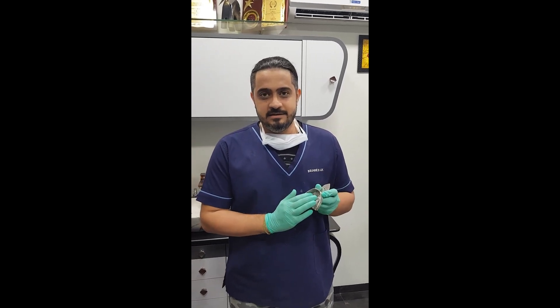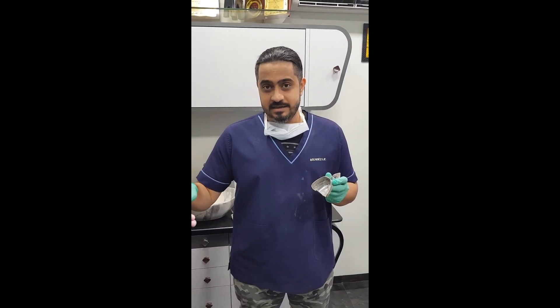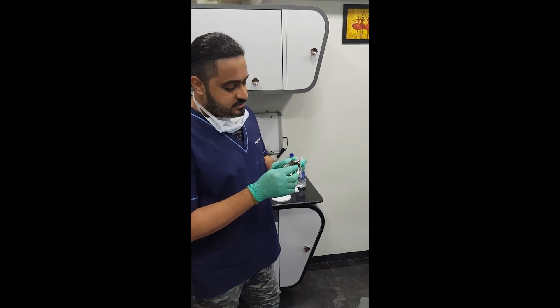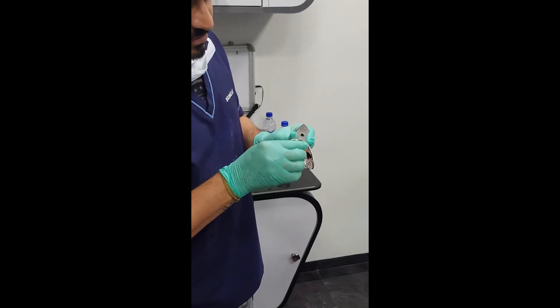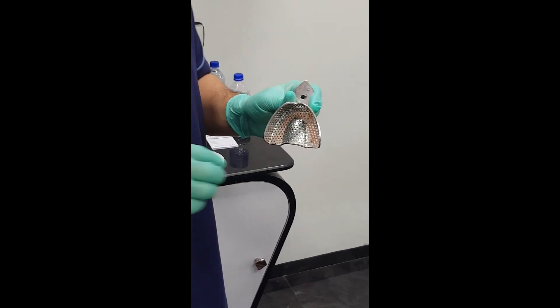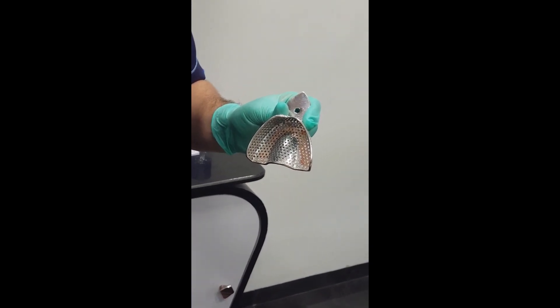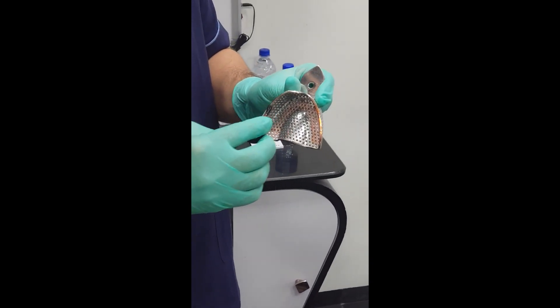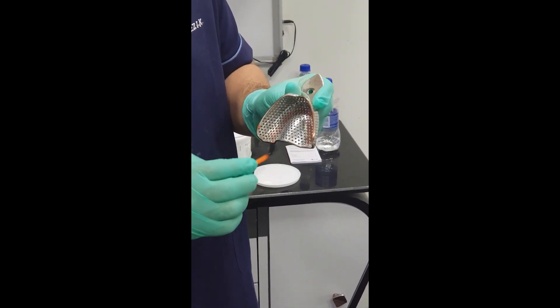First things first, I have selected my impression tray. Although this is a perforated tray, I personally believe it is compulsory at all times to apply tray adhesive. It's important to recognize where the tray adhesive is applied — it is applied primarily in the region where your occlusal imprints are going to be registered. At the same time, we apply it most importantly on the rim. This area is very critical — this is where impression materials tend to separate from the tray. So make sure you've applied a decent amount.